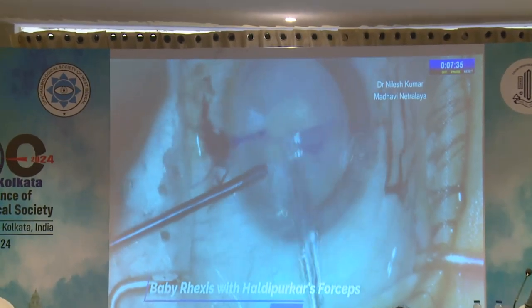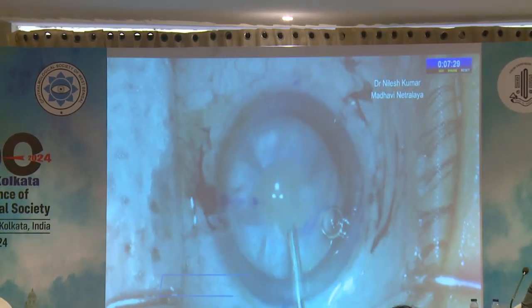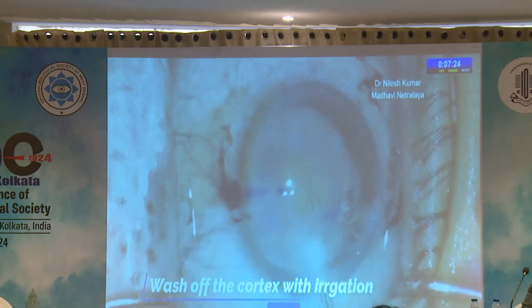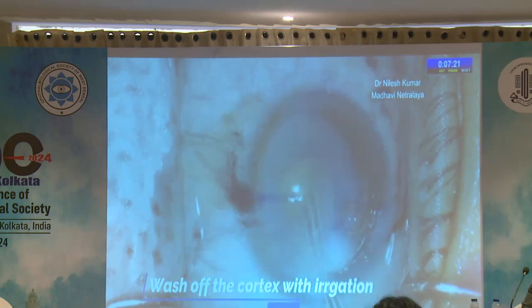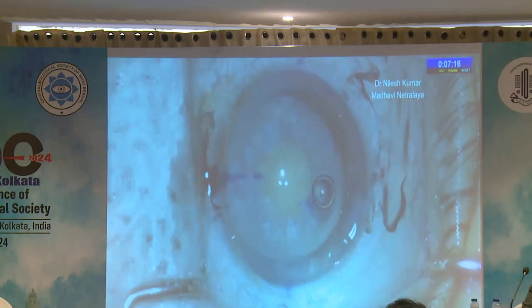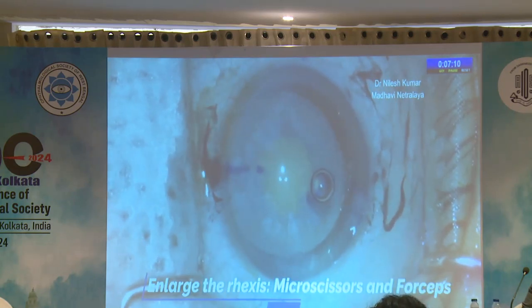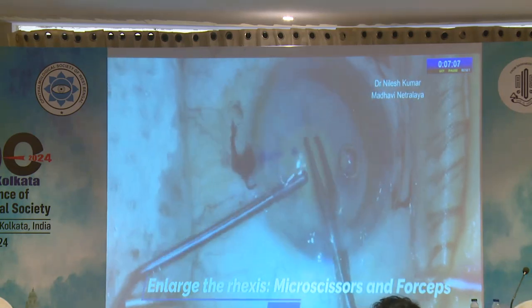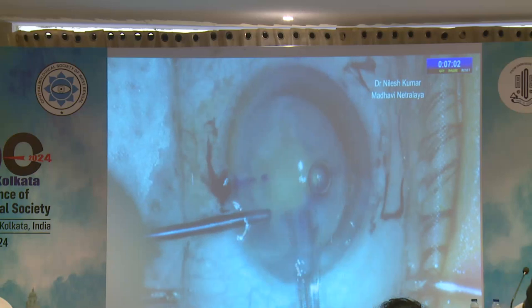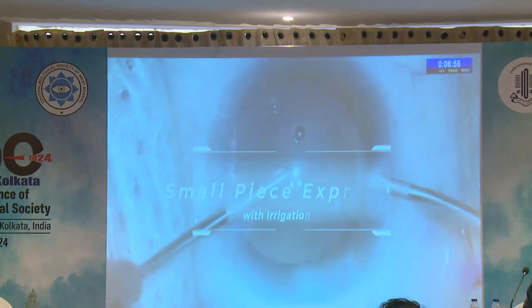we have to decompress. Usually what we do is we do irrigation and aspiration and suck out all the extra cortex to decrease the pressure and then do a double rhexis. But what you can do is just press the lower lip and create a flow of BSS, and you can see how the cortical fibers get loose and come out, and then you have a free floating nucleus, and then you can just snip it with a micro scissor, and then using a Utrata forceps you can do a double rhexis with ease, and you are very safe to perform your phacoemulsification in a beautifully well centered 5.5 rhexis.